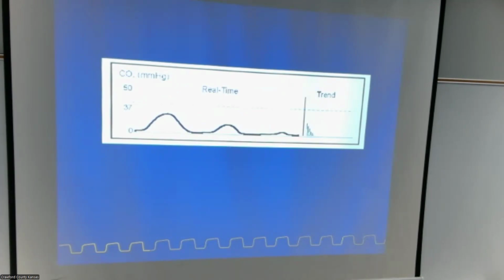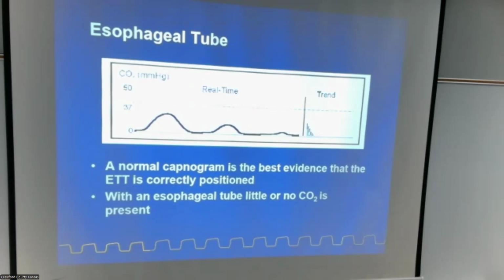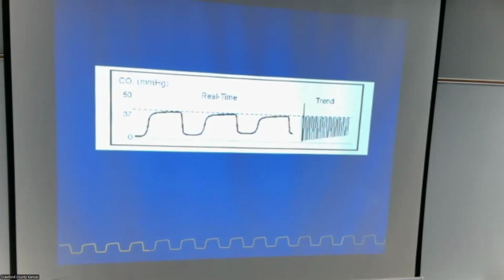So what's going on here? Tubing the esophagus. Low or no respiratory rate. No CO2 is present. Uh-oh.